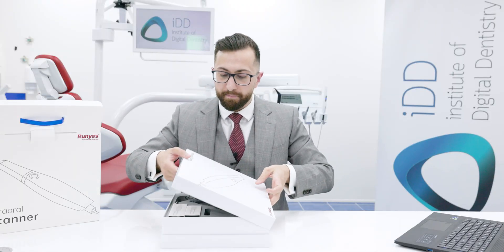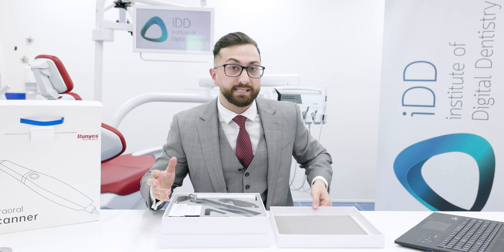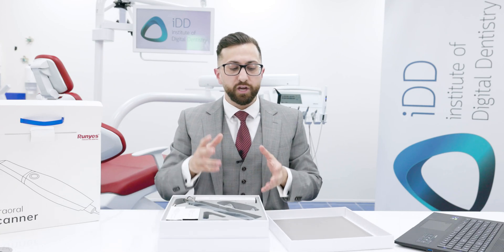Opening this up, it's a bit different to most of the Chinese scanners we've unboxed — they usually come in a travel case, like a hard shell or a metal box. That is not the case here.